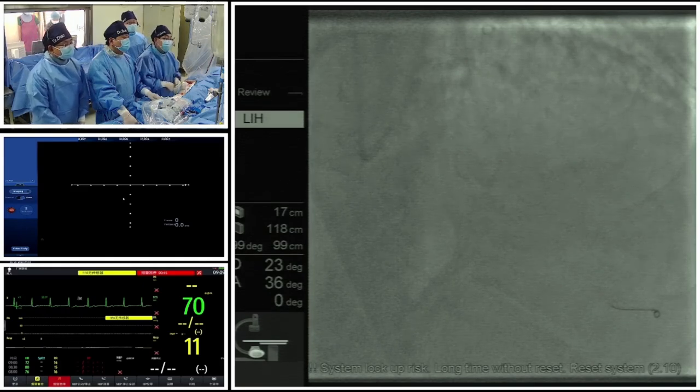Okay. For the virtual stenting technique of QFR, we can say that if we implant two stents in the RCA middle segment, the QFR could significantly increase to about 0.92. And in fact, for this patient, firstly, we complete the RCA PCI. We will show the procedure details.